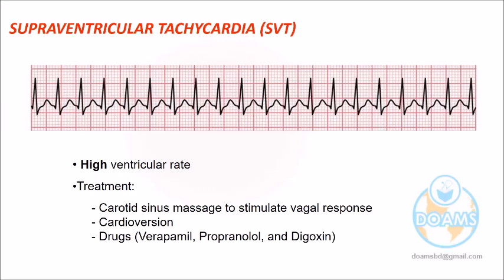But if it is a sinus tachycardia, we can understand that P will usually be visible. Sometimes in supraventricular tachycardia also P may be visible. The possibility is there, it is not absolute. So how are we saying? By looking at the rate mainly. Otherwise, it is regular, QRS is not wide here, so it may be supraventricular tachycardia.